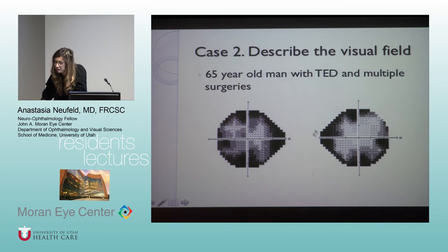And do you know the reason why we get 30 degrees in the nasal quadrant? So the Humphrey Visual Field was designed to check for glaucoma. So by design, the test is to check for visual field deficits associated with glaucoma. And what is the earliest visual field deficit commonly associated with glaucoma? It is a nasal step. So this is why you have 30 degrees here, and that's why they kept it when the 24-2 algorithm was designed versus the 30-2, which is an older algorithm, in order to speed up the test, reduce the amount of visual field, but still keep your sensitivity up for a glaucoma visual field deficit. So hence you have the 30 degrees nasally that is kept in the 24-2.